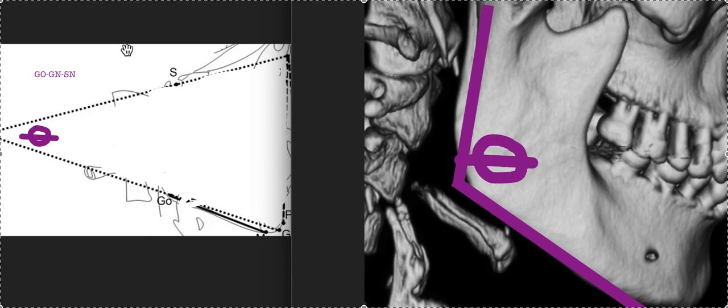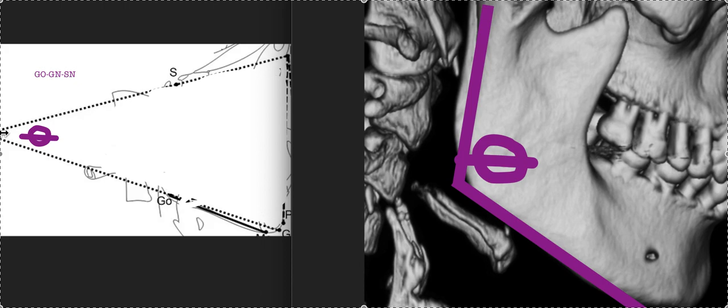This angle can change with expansion because your mandible is on a hinge axis. So if you do some type of expansion, the palate denture base is going to change. It might change position or inclination, which would then change this theta back here. I kind of cut it off, but you get the idea. So this is what you need to measure and keep your eye on with expansion: your GOGN-SN or your mandibular plane angle, which is your SN-GO-ME. Hopefully that was helpful. Thank you.